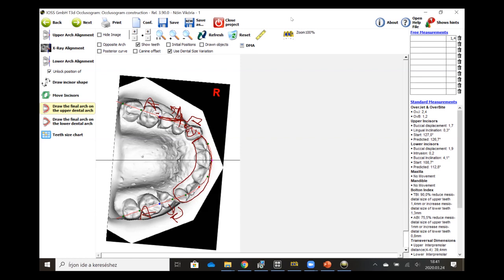Now, the main thing that you have to do here is the movement of the anterior. You have to analyze the movement with DMA if you want. Yeah, I put it in the DMA, but I didn't know that I can move the whole group, the 5. Okay. So that's interesting anyway. We will review this again, and no, that's no problem.